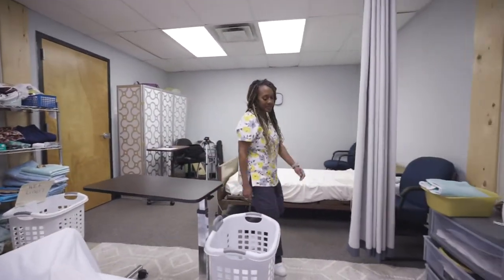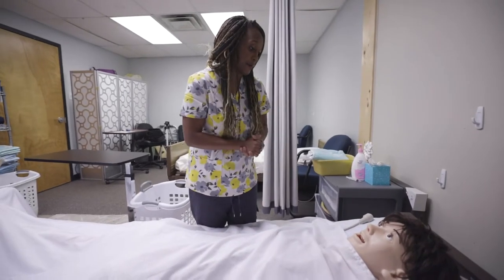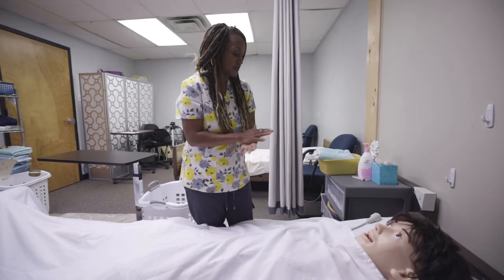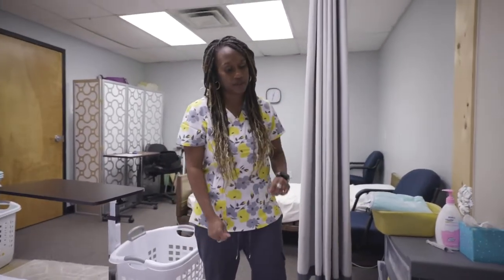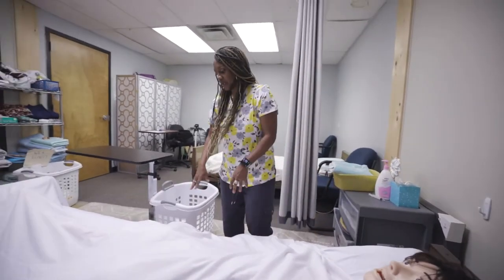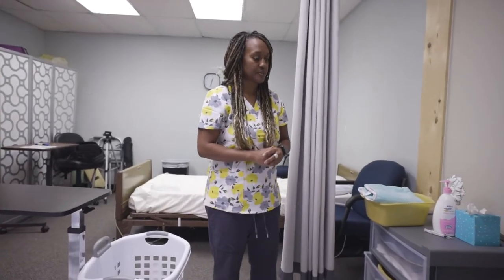Hi Mrs. Smith, how are you? My name is Nikki, I'm your student nurse aide for today. Today I'm going to clean your catheter — is that okay? First I'm going to wash my hands, lock your wheels, pull the curtain, make sure your call light is within reach, which it is, and your bed is at a safe distance. I've already washed my hands, so I'm going to go gather my supplies.